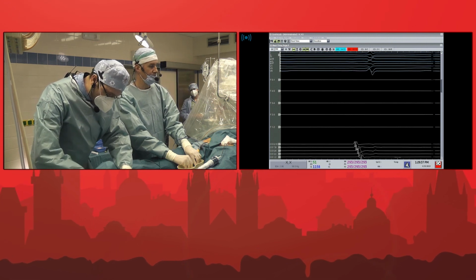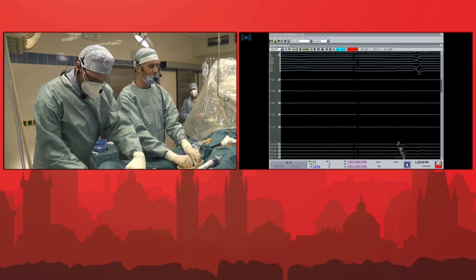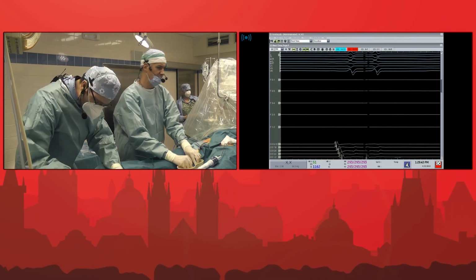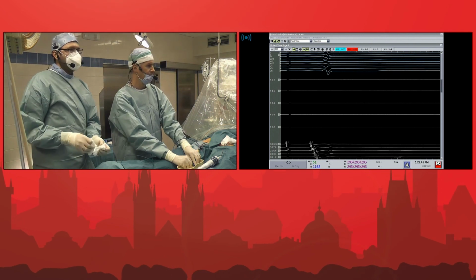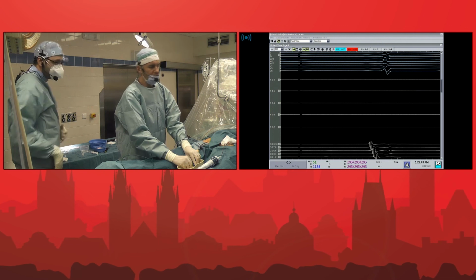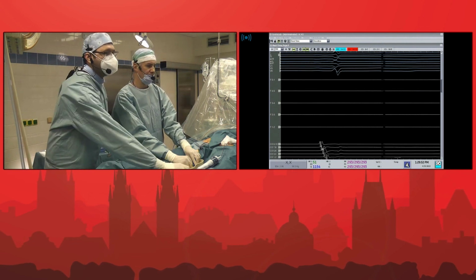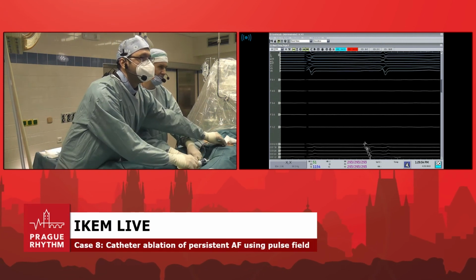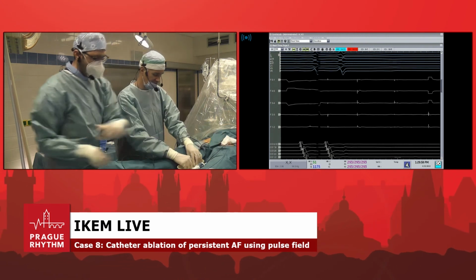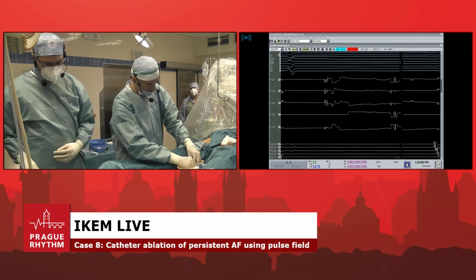Just 2 minutes, okay? Just to sum up. We mapped this arrhythmia where it was stable. We see that it's definitely contained in that anterior aspect. So we're going to apply two application sites over there in the anterior, gently standing from anterior. This is our plan, okay? Then we'll give you feedback when we come back. So we are coming up with a FARAWAVE.